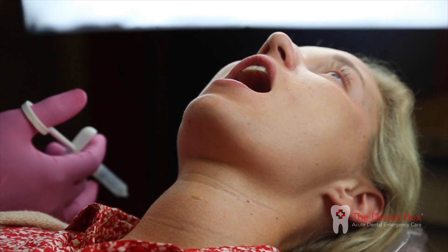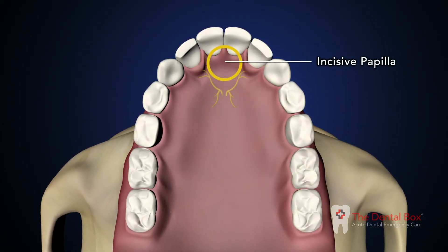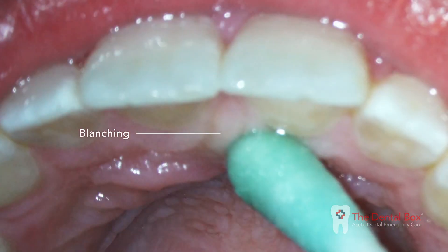Use a cotton swab to apply moderate pressure on the incisive papilla, which is the soft tissue bump just behind the central incisors. Note the blanching of the incisive papilla.